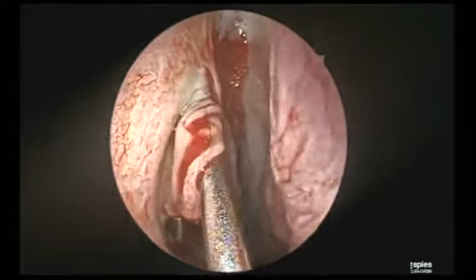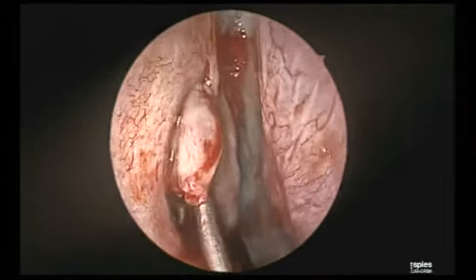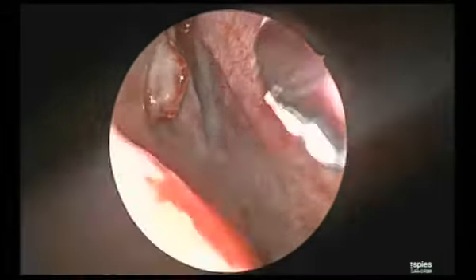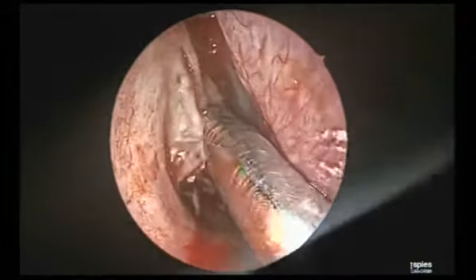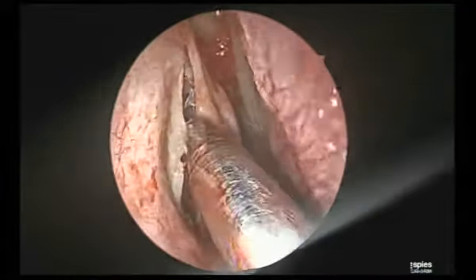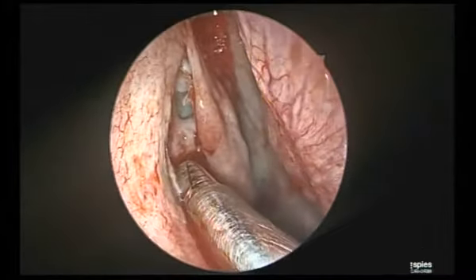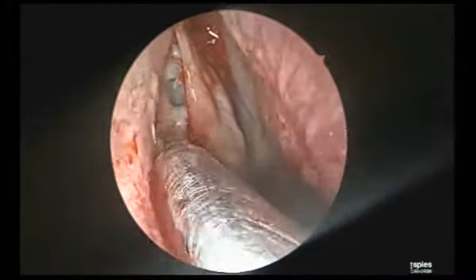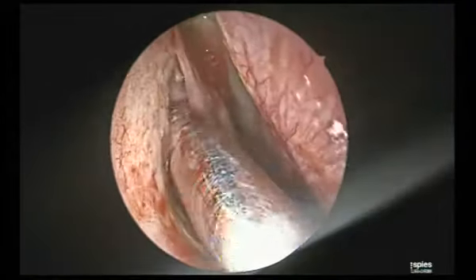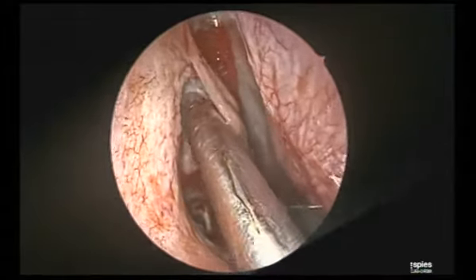So this is for the junior colleagues. What I am doing, everyone can do if you have a good visualization. This is actually the secret of a good uncinectomy. What he has done is mobilize it to the anterior most limit, and then the debrider has the intelligence to do it. See, this strategy is developed with a simple philosophy. Like for the uncinate, bulla or any cell, you stay away from the critical area, bringing it out, away from the structures behind, so you don't damage anything. That is the simplest philosophy.